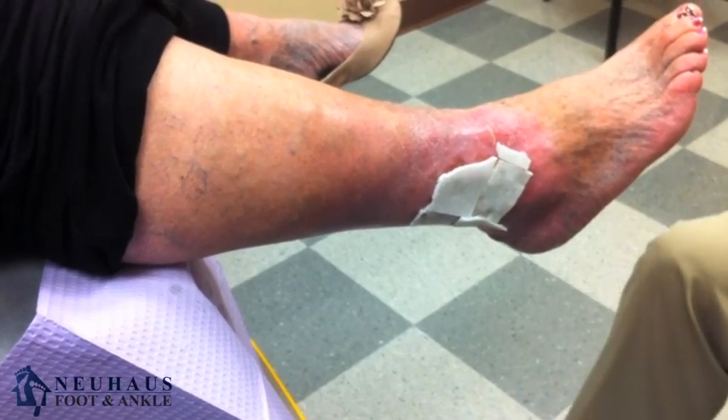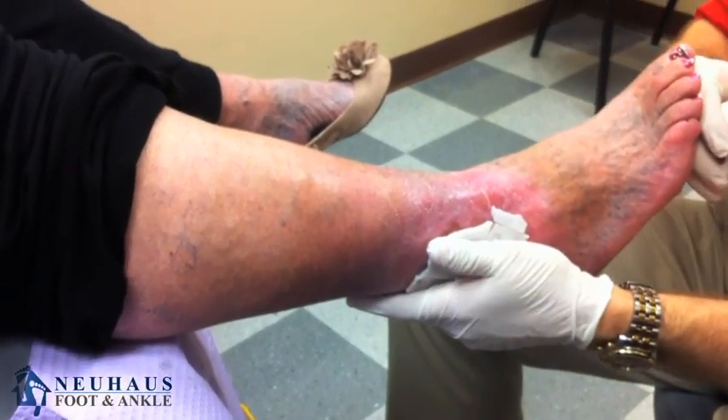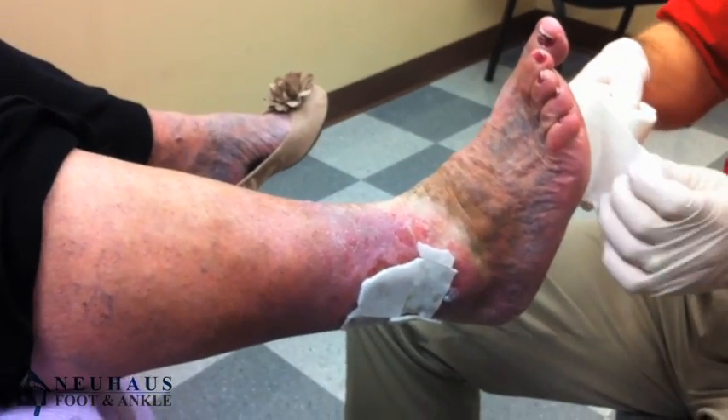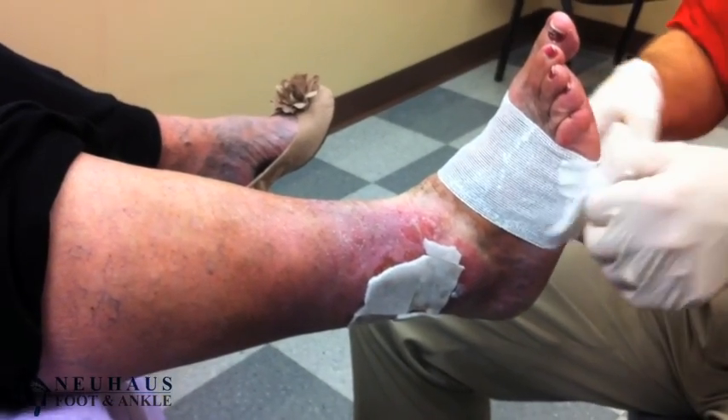Then we wrap it with what's called an Unaboot. An Unaboot is nothing more than basically a gauze wrap with zinc oxide — kind of the same stuff you'd use for a sunburn or to prevent a sunburn. It comes in a roll and rolls on very easily.